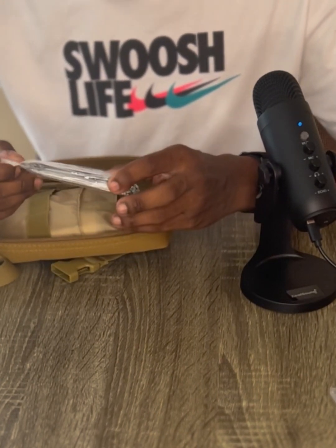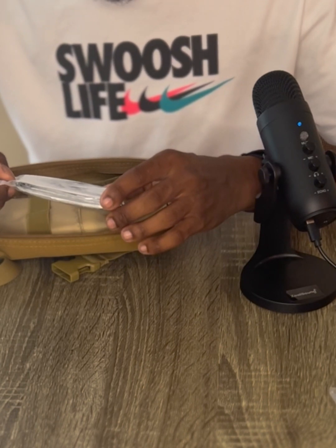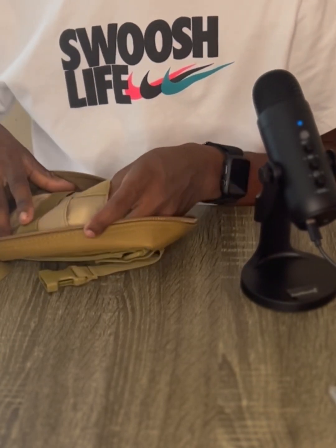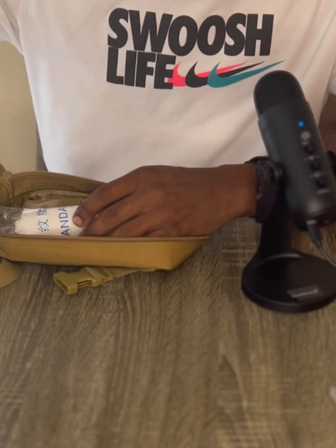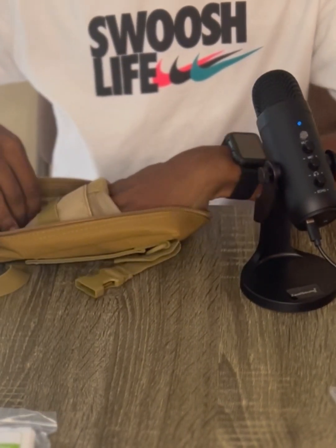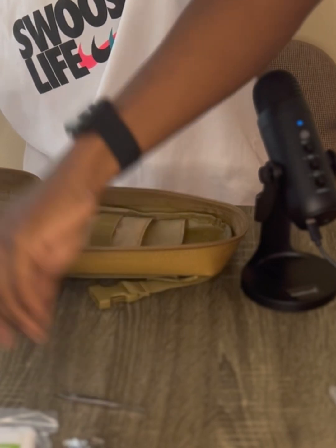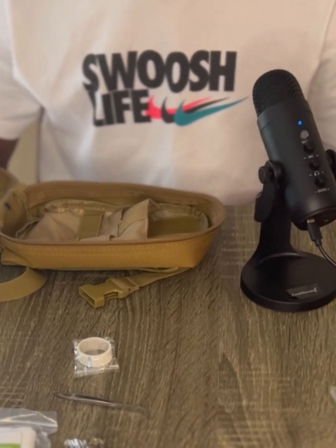Alcohol prep pads — looks like about 30 of those, not bad. Two antiseptic towelettes. An emergency rescue blanket — says single use, reduces shock, keeps patients warm, dry and clean, helps against hypothermia, simply wrap around total body leaving face uncovered. That's a nice addition — first time I've gotten one of those in a med kit. Some triangular bandages for slings or splints. Some regular bandages, clothes pins, tweezers, and medical tape. That's everything in the first aid kit.